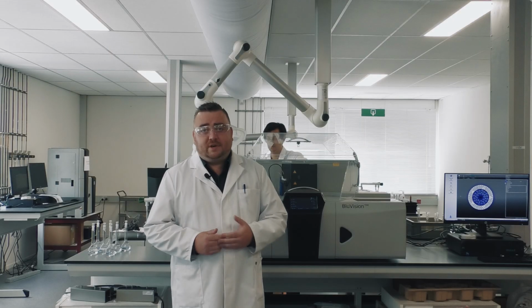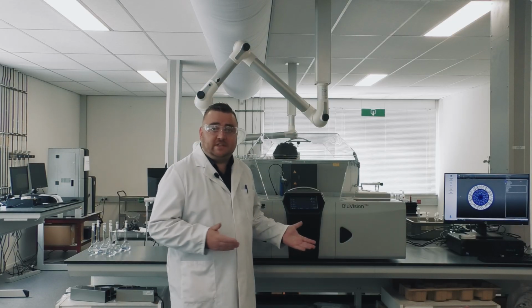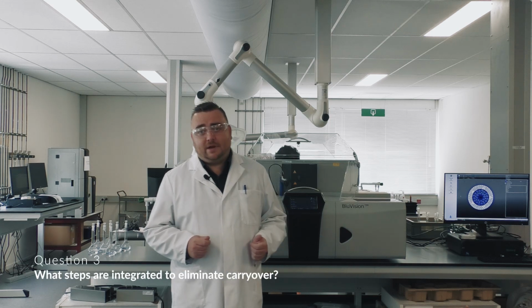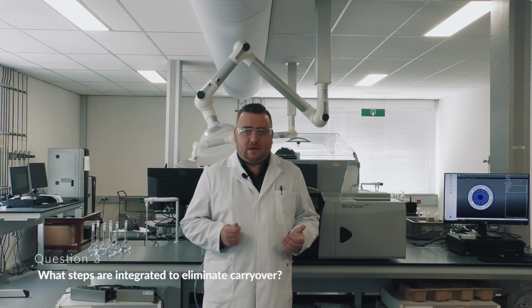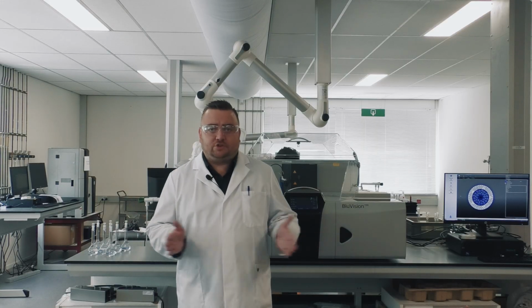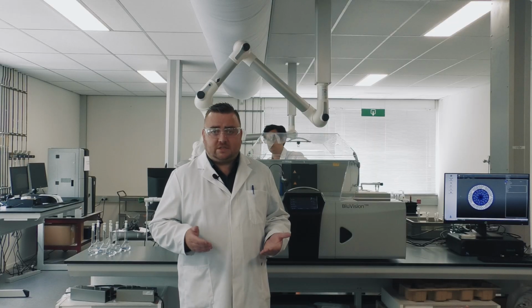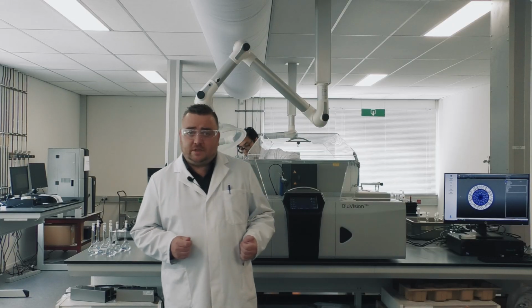So question number 3 is related to carryover and the steps we have integrated to minimize or even eliminate carryover between high and low range samples. So this is basically a 3-part answer. The first being that naturally between every step the analyzer takes, there is a very robust washing step, rinsing step for both the inside and the outside of the needle.